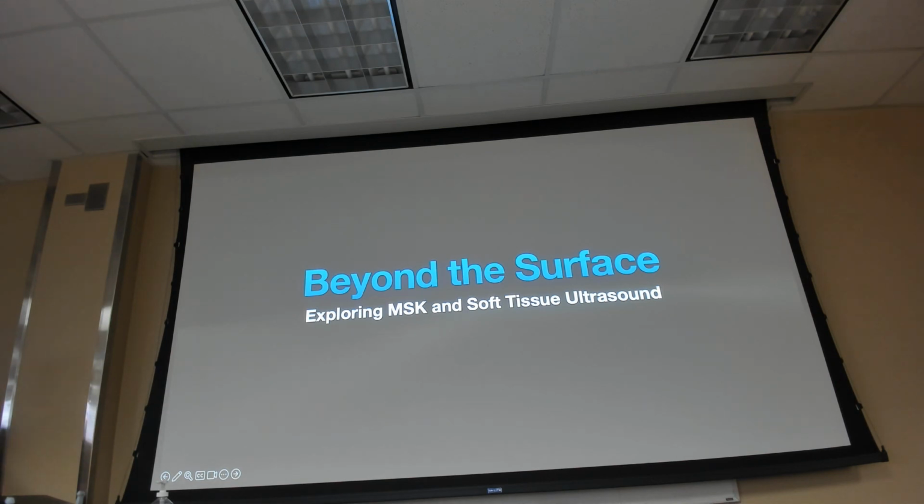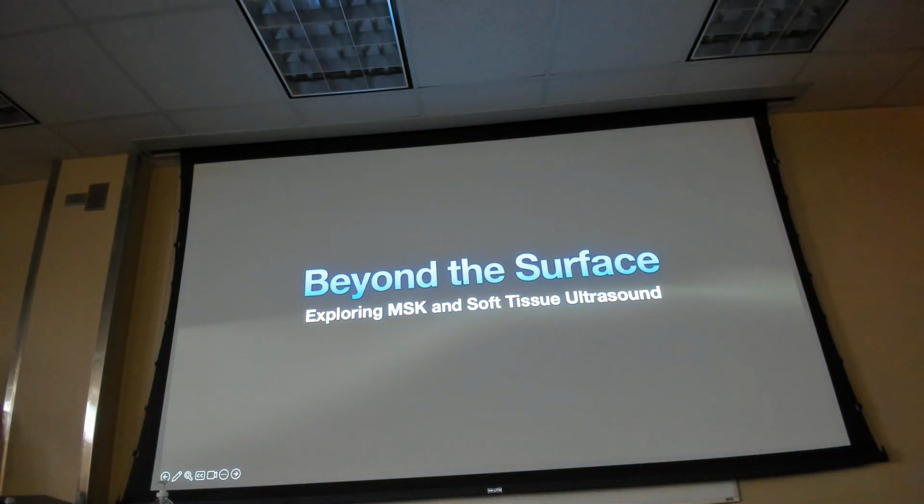So MSK. We've talked about some indications for ultrasound in the MSK population, like patients with MSK complaints. Is that a very common thing that we see in the military? Yeah, so this can get quite extensive. There are very dynamic ultrasounds done by the radiology team. They can do very specific MSK ultrasounds, and they're becoming more prevalent, where we're actually ordering fewer MRIs and doing more MSK ultrasounds because it's dynamic. You can put a patient through a range of motion. Physical therapists are using it all the time.